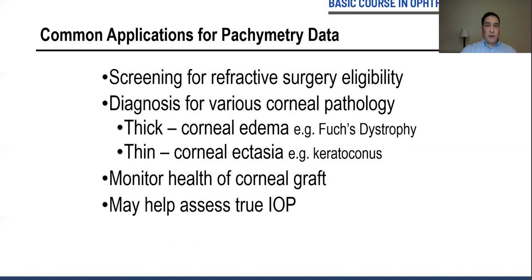What are the common applications for pachymetric data, or the data for the thickness of the cornea? Most common, of course, is screening for refractive surgery eligibility. Nowadays we don't do LASIK or PRK without knowing how thick your cornea is, to see how much treatment can be applied to your cornea. That's the single most common application for corneal pachymetry today.